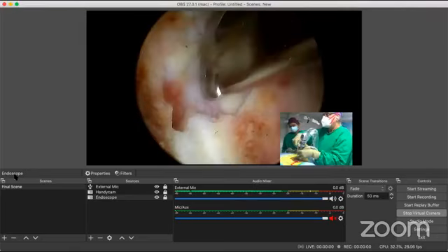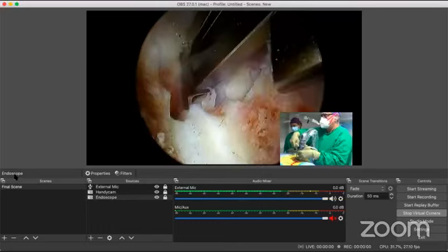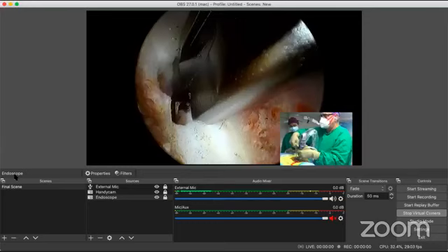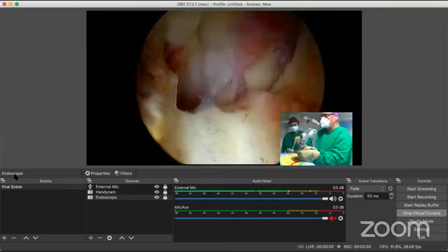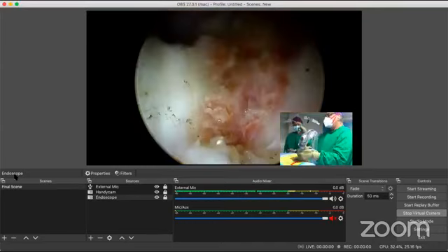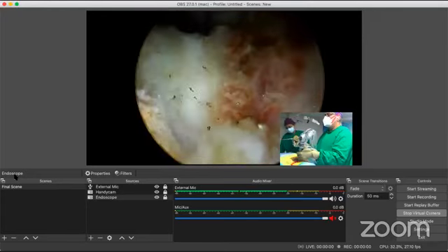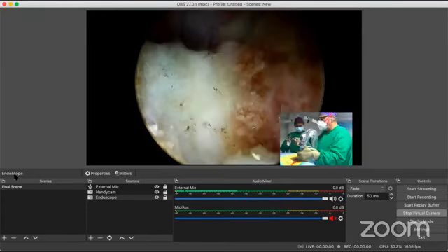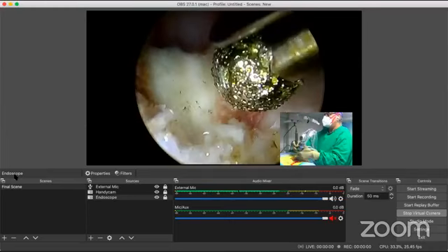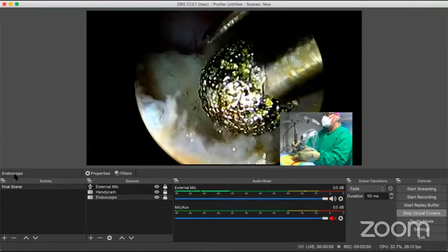And you can see how nicely we are chipping and chopping away, going laterally onto the root without actually even bothering to go towards the spinal cord as such. There's a lot of bone here which we can burr. So I'll prefer to do a little burring and thinning before I go further. So I'm going to place myself here away from this dura. Burr, please. Burr.